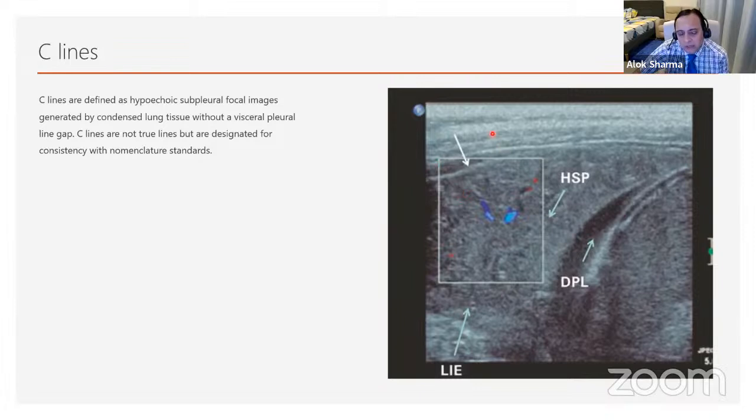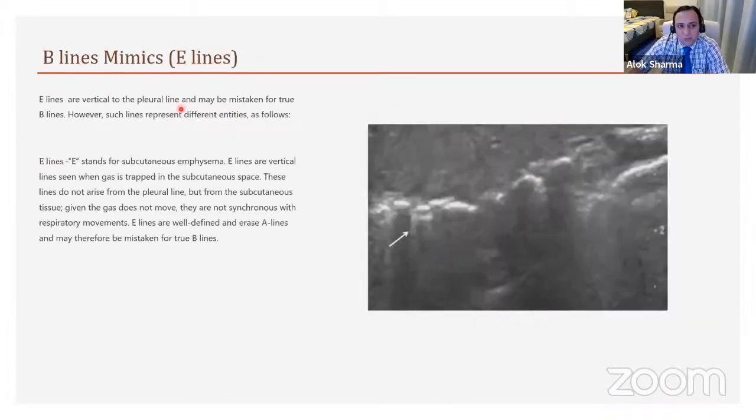Now, the clinical correlate for us in neonates is what we call the fractal sign or the shred sign. In that, the pleural margin becomes very irregular with a lot of hypoechogenicity, whereas the margin above may be irregular or destroyed. That is classically called the fractal or shred sign. But this is just for terminology. Don't get too hung up on it.